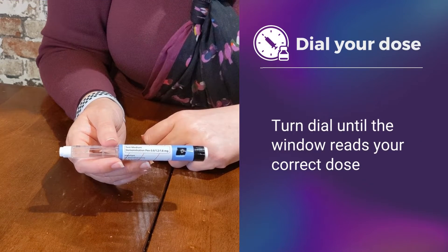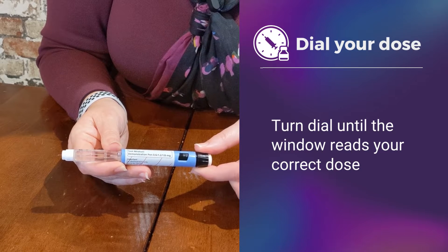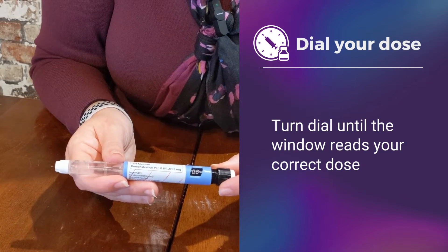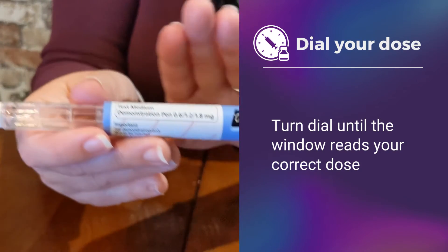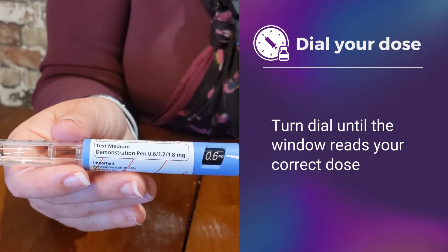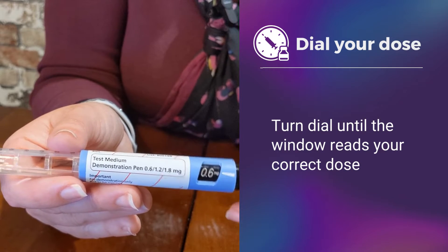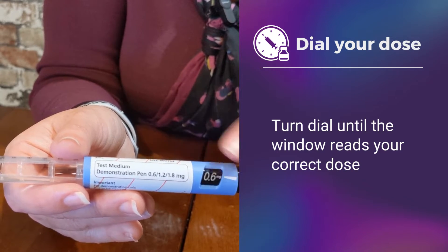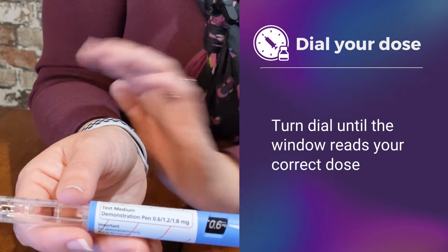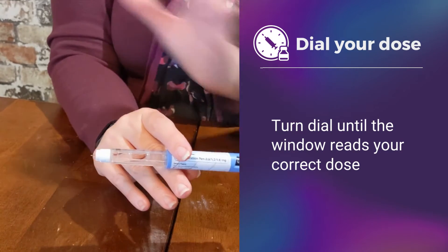Now the pen is primed and we are ready to dial your dose. Touching this black portion, we are going to twist and go past those dashed lines. If you were starting at 0.6 milligrams, that would be this position. If you had a higher dose such as 1.2 or 1.8 milligrams, you would continue to twist the black portion until you can see that dose in this window. Once your dose is at the proper spot, you are ready to give your injection.